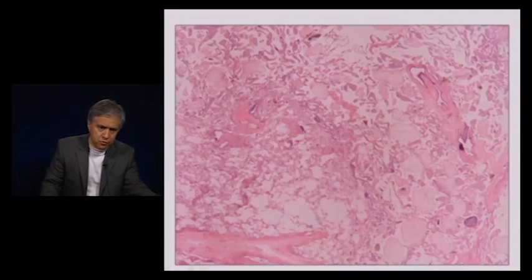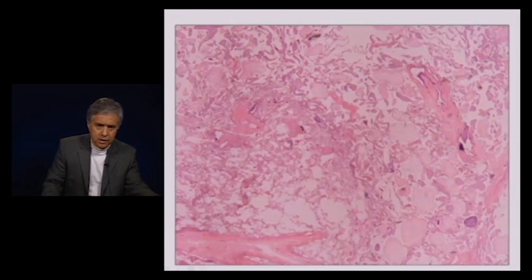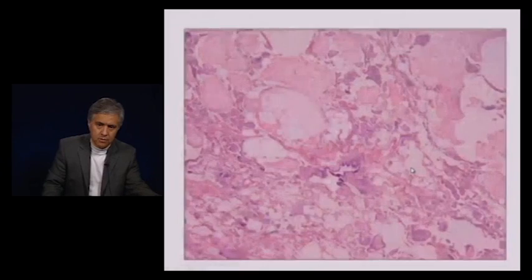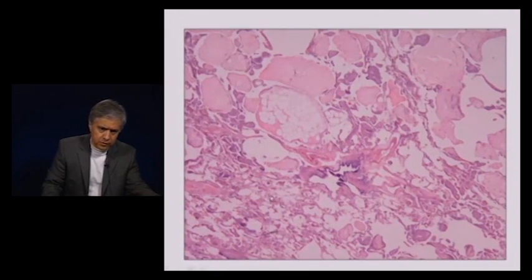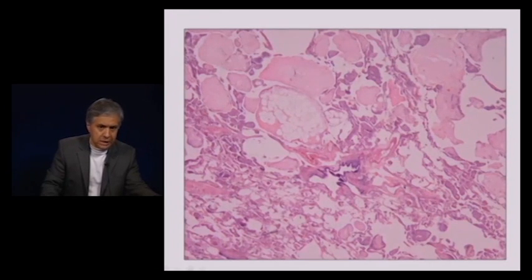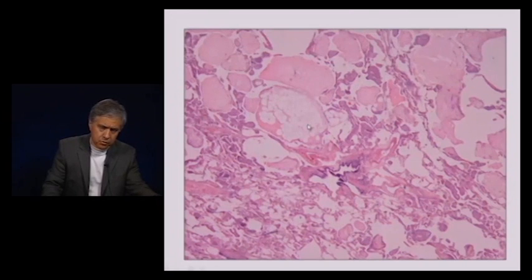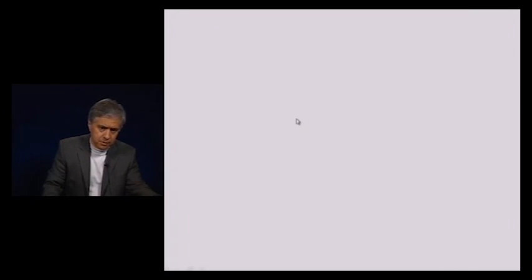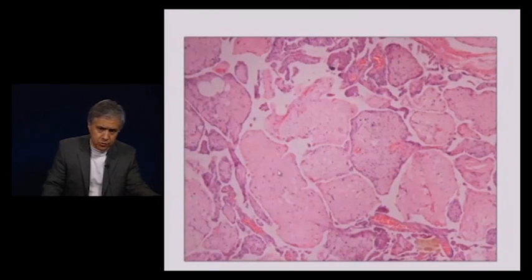Histologically, what we have is portions of lung parenchyma. But then you start seeing these areas — almost like papillary areas — that are clear and present along the alveolar wall or sometimes within the alveolar spaces. At higher magnification, for comparison, we have normal alveolated lung parenchyma, and we have some of these structures filling some of the alveolar spaces. In other areas, this is clearly abnormal. These round areas in some regions are composed of myxoid fibrinoid material, while in other areas they are clearly represented by mature adipose tissue.